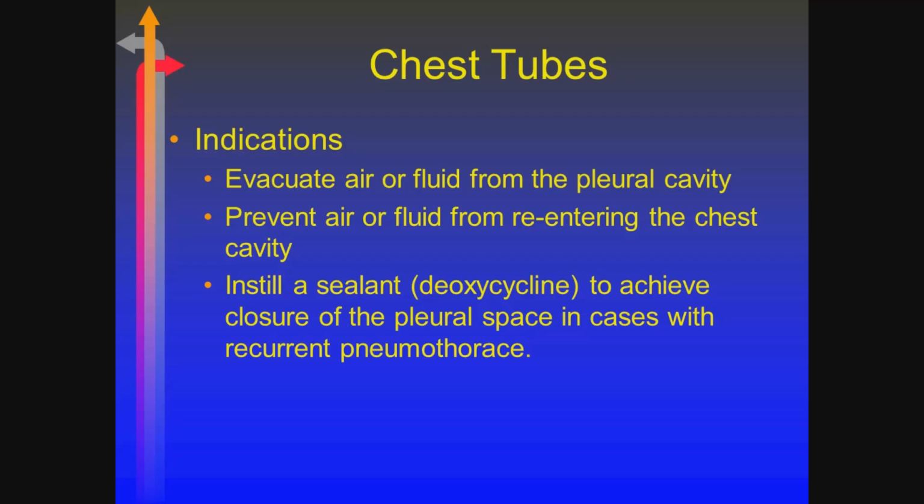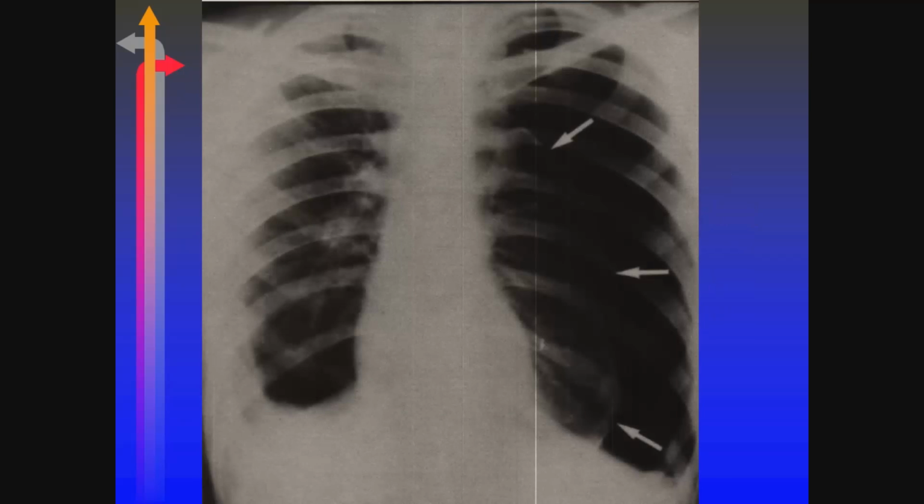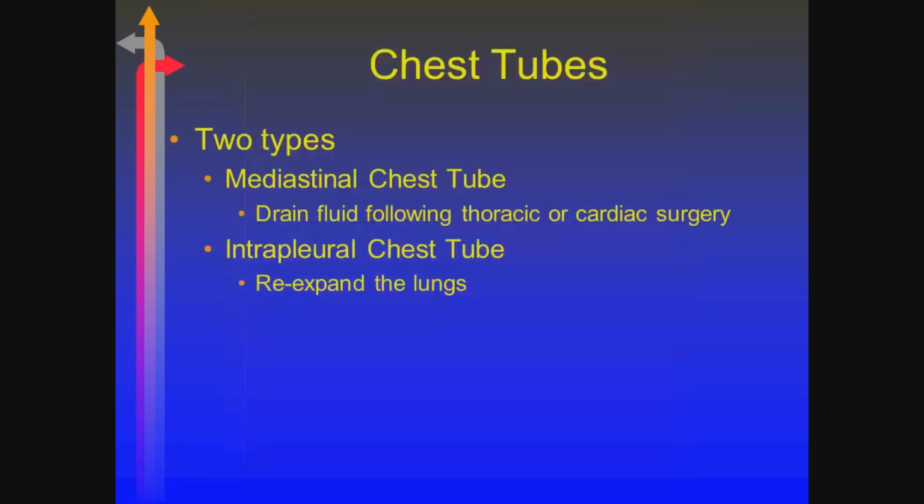And then also we have this process where we do a pleurodesis, where we're putting a substance in there to prevent recurrent pneumothoraces, and that's the agent that is commonly used there, the doxycycline. Can't see it really well on here. I can see it greater on mine, but there is a definite spot here where you can just have a well delineated pneumothorax. You can see there's no vasculature over there where there is on that side.